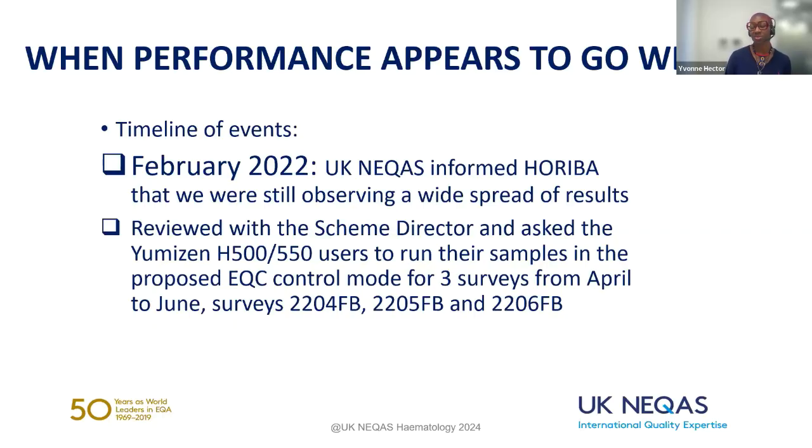And when Horiba had replied to us about this, they also informed us that the machines were on different software versions for these analyzers, and they proposed that, for example, the H500 users who were on software version 2.2.2 were to run the EQA samples in the EQC control mode.